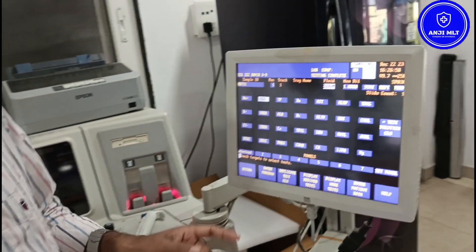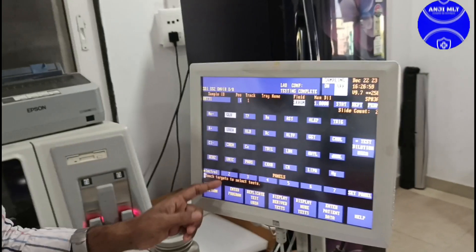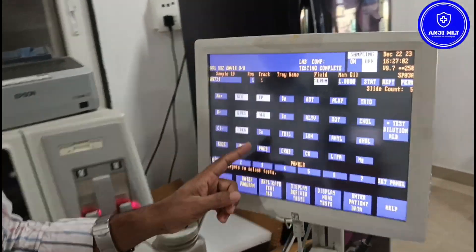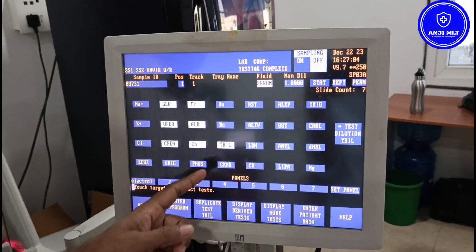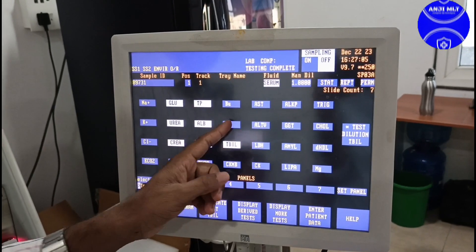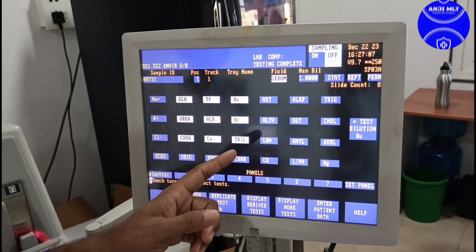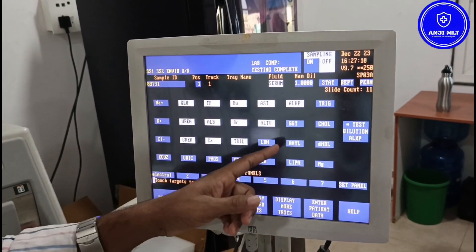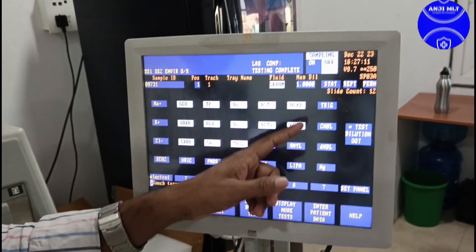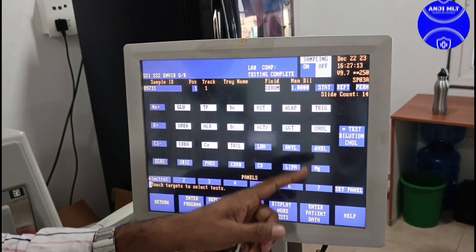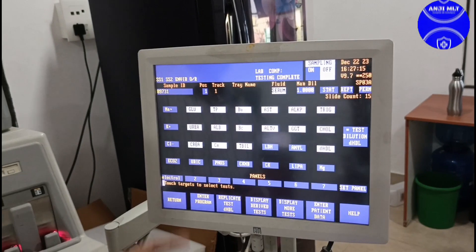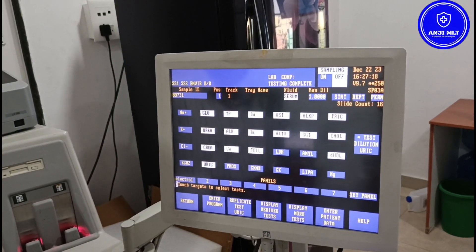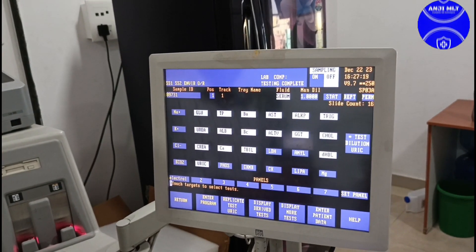For example: glucose, urea, creatinine, total protein, calcium, total bilirubin, conjugated bilirubin, unconjugated bilirubin, AST, ALT, alkaline phosphatase, GGT, triglycerides, cholesterol, HDL, and uric acid. So all these parameters are included in the QC run.